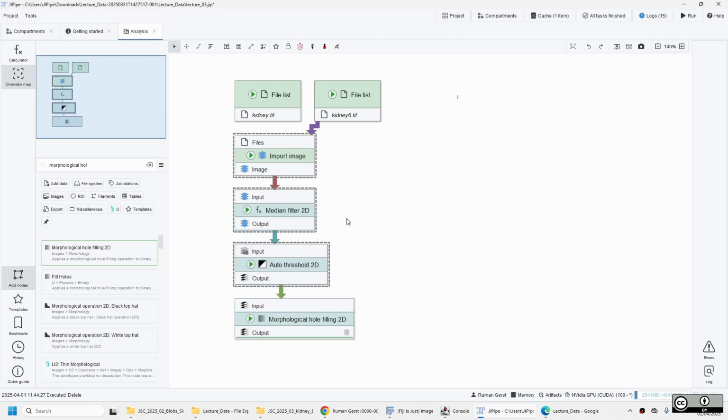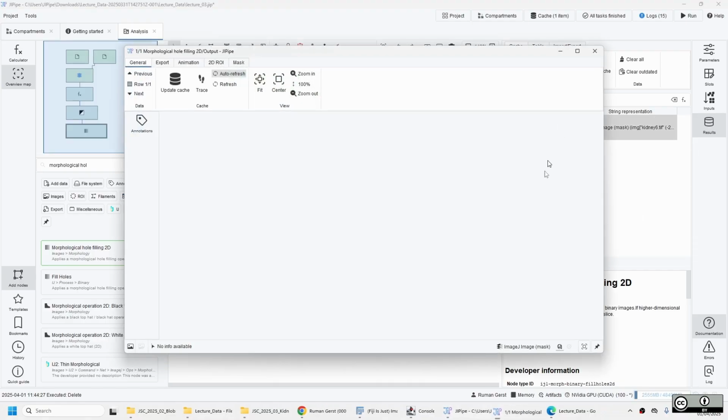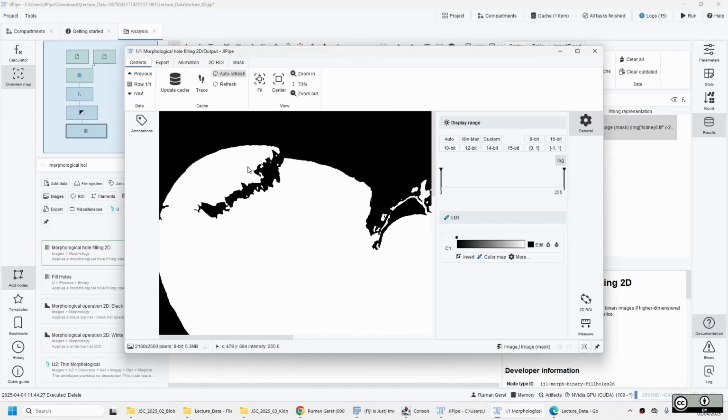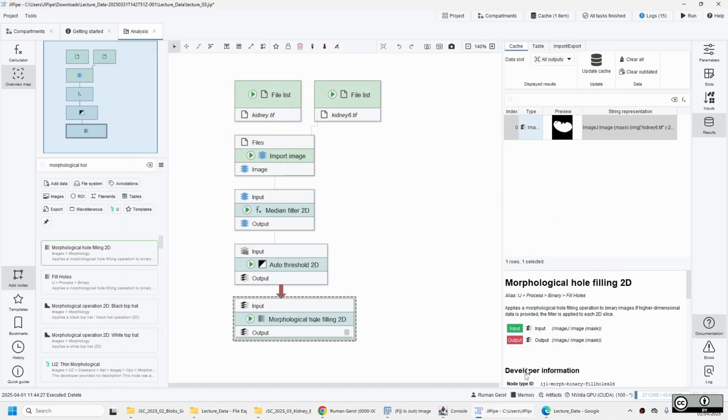And it's smart. It knows when something changes and understands, okay, I have to clear this because it makes no sense, something changed. And it will rerun this later on. Then it stored only the morphological hole filling here. With this data, and that's why I wanted to show it to you, you see already in the picture that our hole filling failed. This is quite inconvenient. And why is it? Let's maybe check the original data.